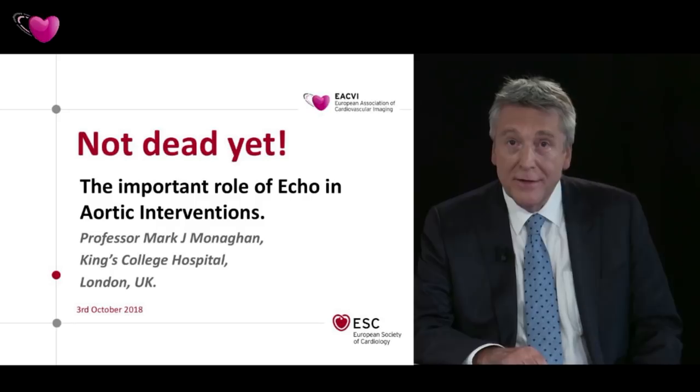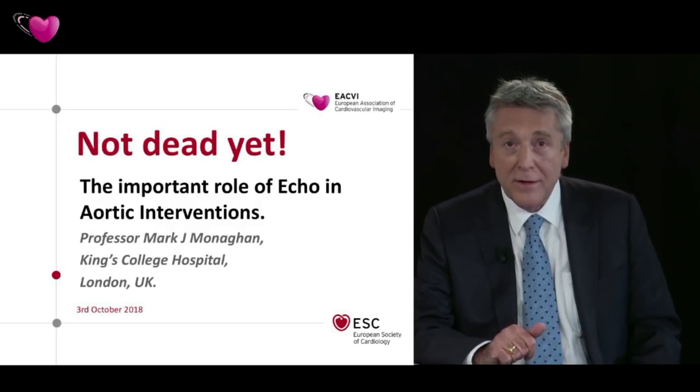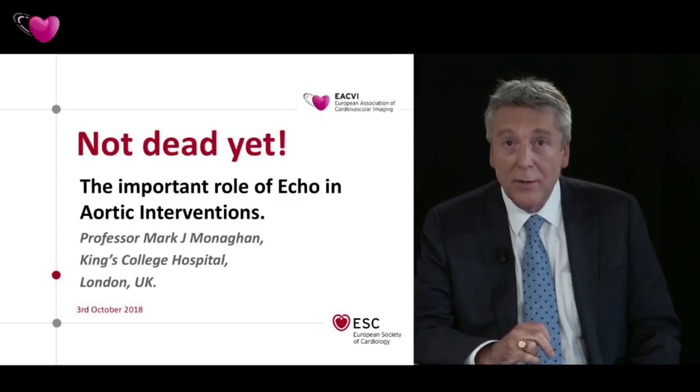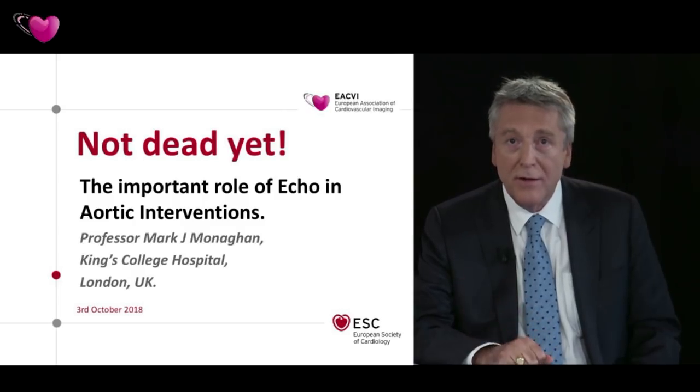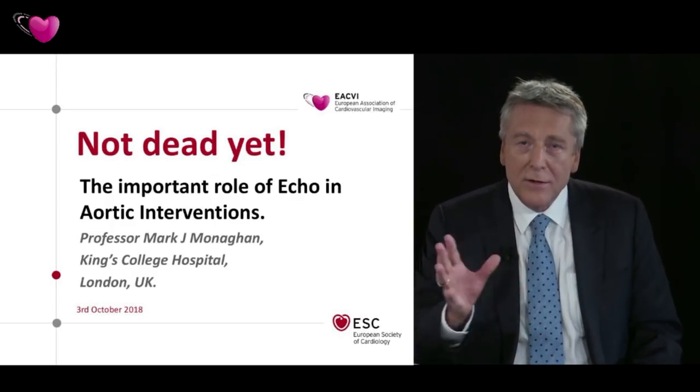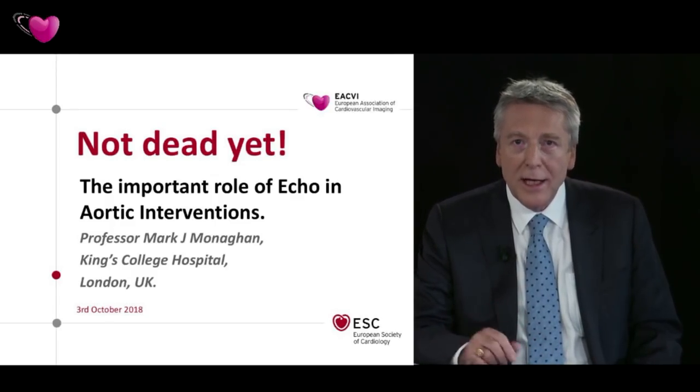And indeed, since we started our TAVI program at King's back in 2007, we've been using 3D TOE for sizing the majority of our valves and only really use CT when we can't do TOE. So I'm going to take you through some things that we can do with echo so you can be aware of that.